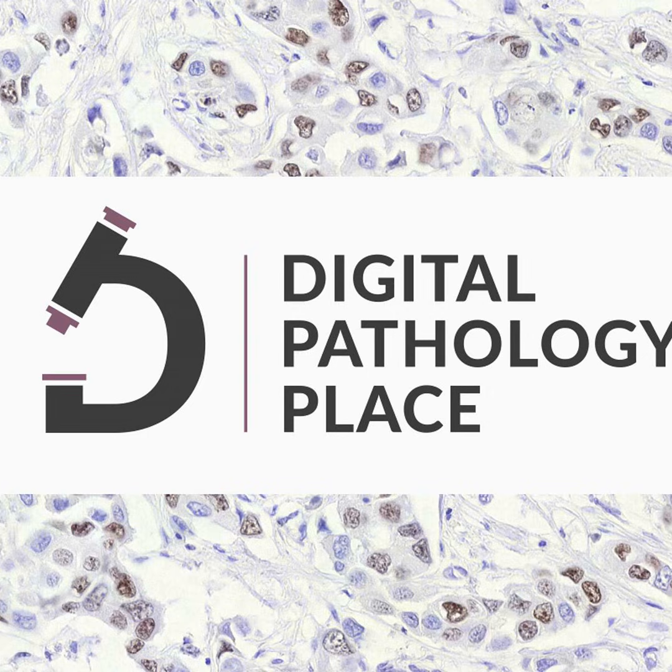valuable. And then you move on to the cell analysis, where we're trying to detect nuclei and measure cytoplasmic expression, membrane expression. I feel like deep learning methods have really been a game changer in the last 5 or 10 years in being able to accurately segment cells.